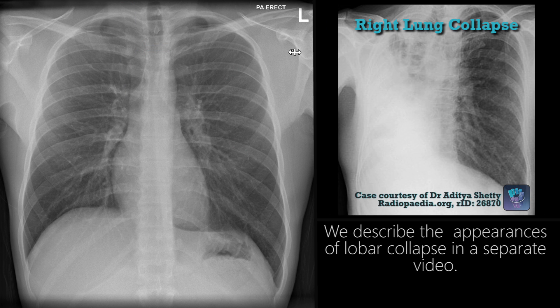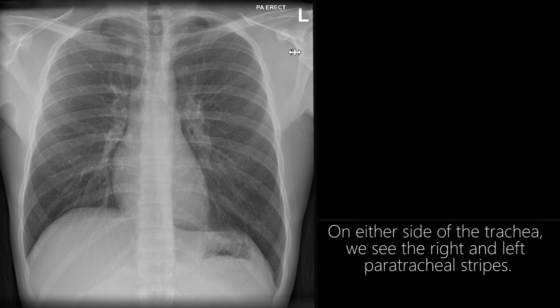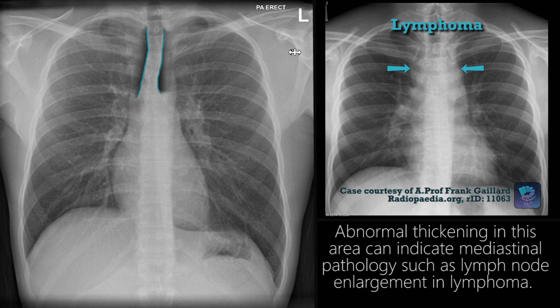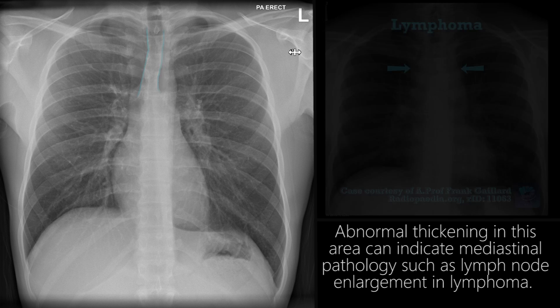We describe the appearances of lobar collapse in a separate video. On either side of the trachea, we see the right and left paratracheal stripes. Abnormal thickening in this area can indicate a mediastinal pathology, such as lymph node enlargement in lymphoma.